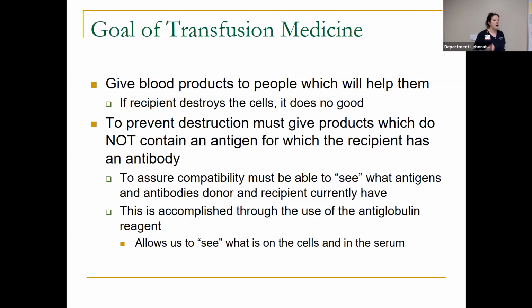So that's why compatibility is a huge concern in blood bank, in identifying any antibodies. If we identify an antibody, we want to make sure that we find, for red cells, antigen negative to the antibody that they built. Especially if they have a positive DAT, that means that they already have an antibody that is coating the red cells, or it could be complement as well.